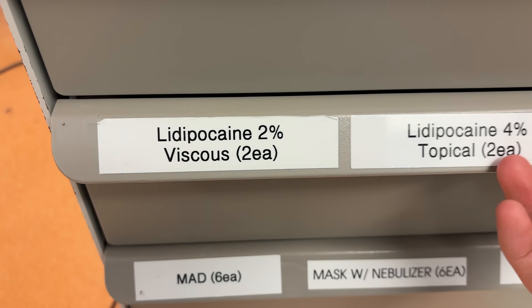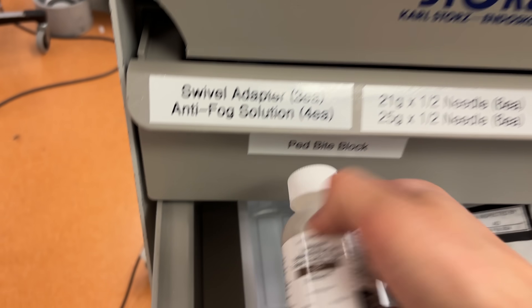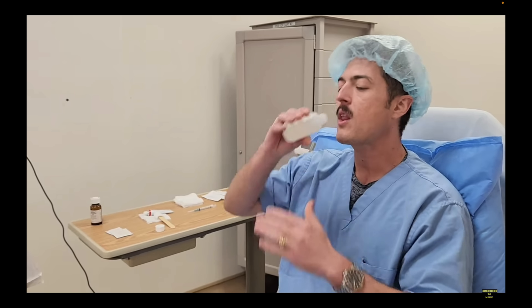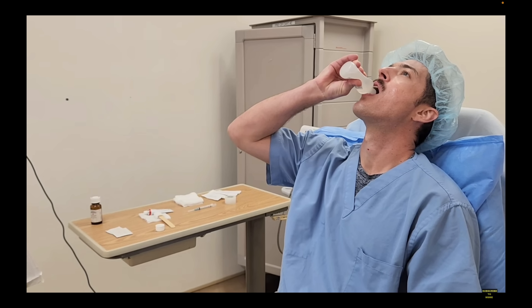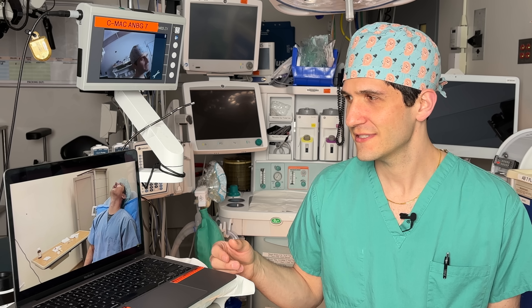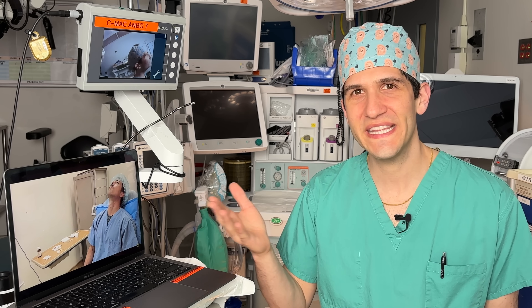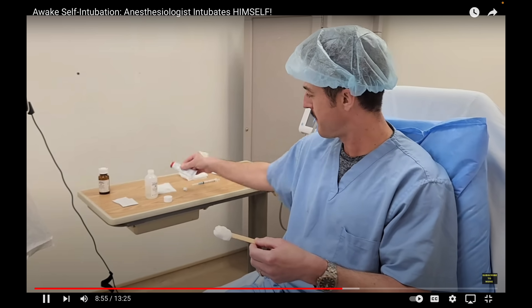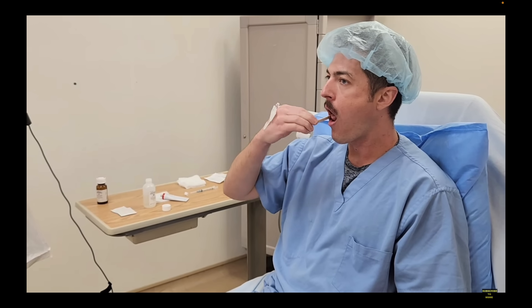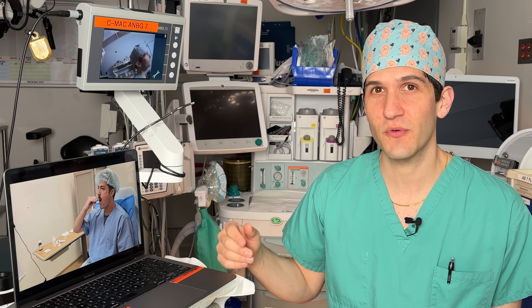The next thing you'll see is that he's going to gargle a different form of lidocaine, which again is just going to help numb the area that's going to be affected in the procedure. What he's about to gargle is called viscous lidocaine, and usually we measure out a specific amount. In doing this, he's numbing up the back of his mouth. Now he is applying some lidocaine to a piece of gauze attached to a stick that he's going to put in the back of his mouth to make sure the back of the mouth is as numb as possible before he gets started.